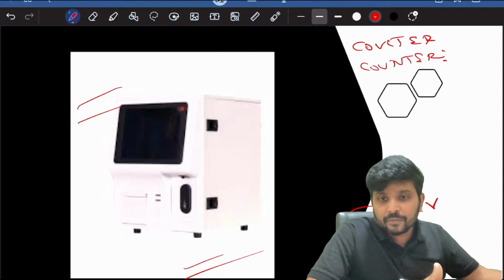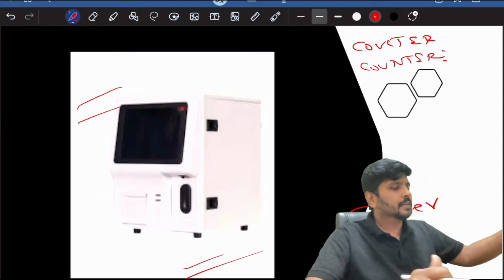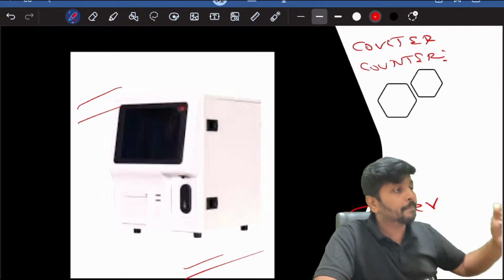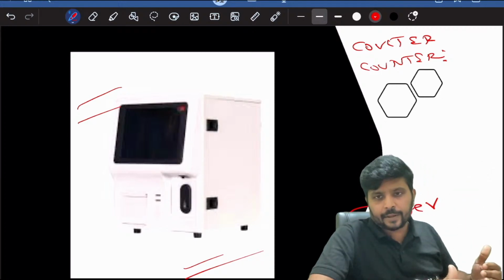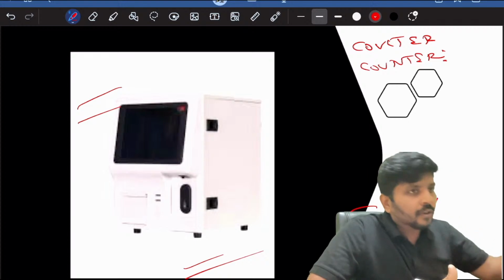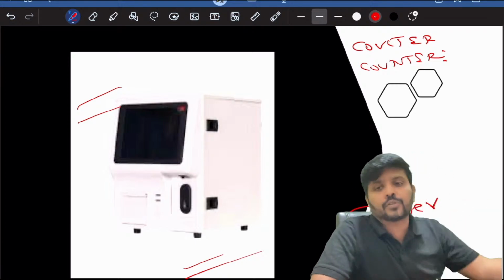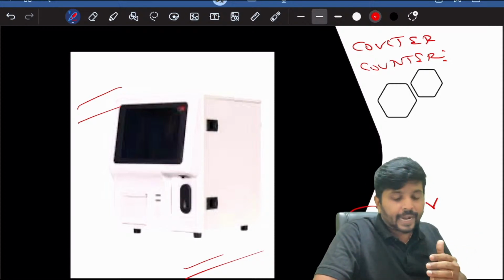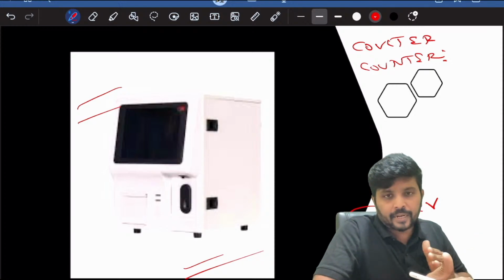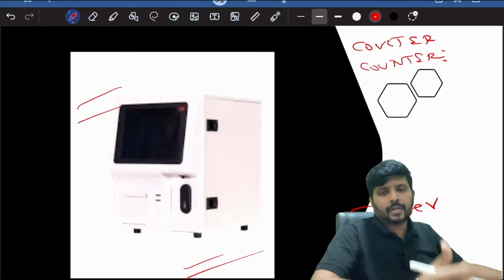Based on that, you can tailor-make your treatment, because if you have a neutrophilia, it can be a leukemoid reaction, and you can start an antibiotic. You can see a number of neutrophils with bands. It means so many immature cells are released from the bone marrow. So what does it mean? You can plan your management as early as possible when the patient comes.